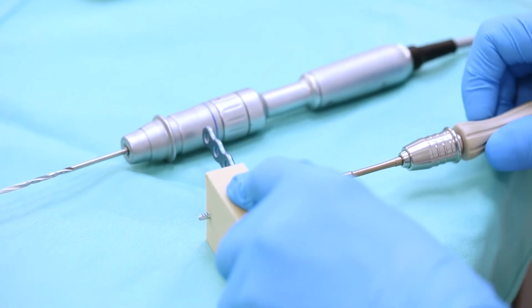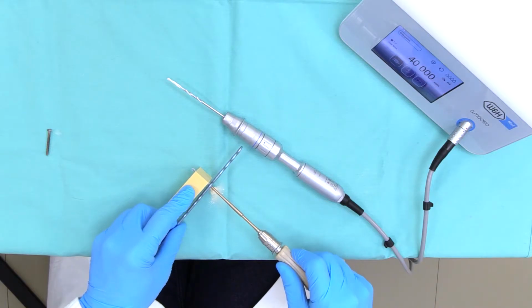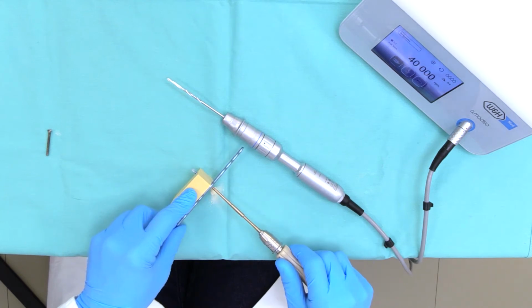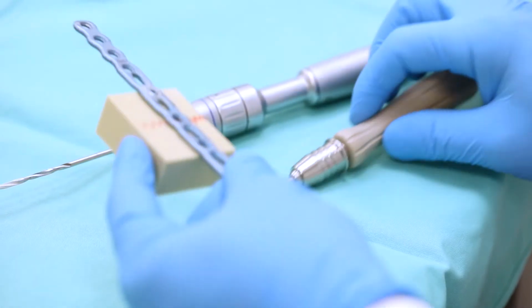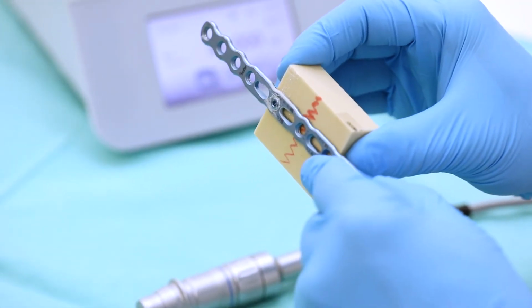By using a conventional screw, you can see that the screw now brings the plate to the bone. The plate is now fixed on the bone and is relatively stable.